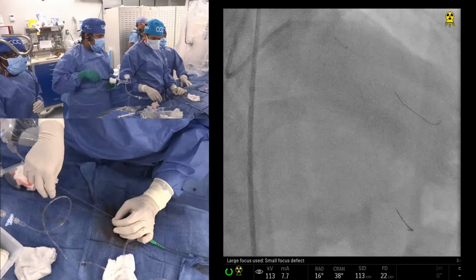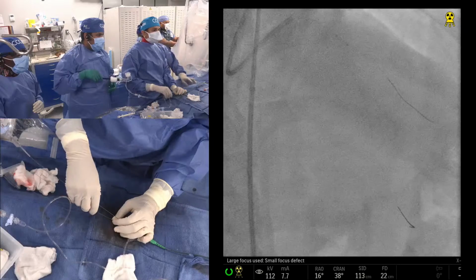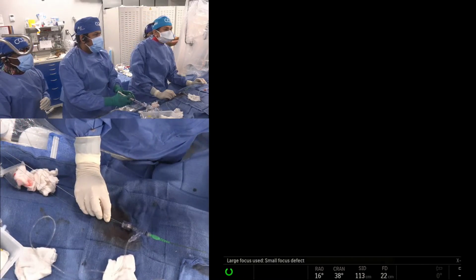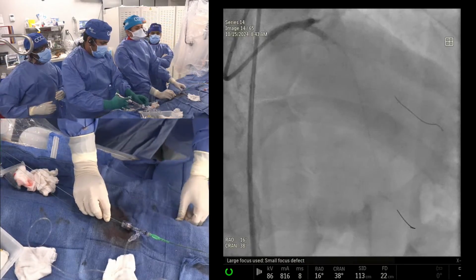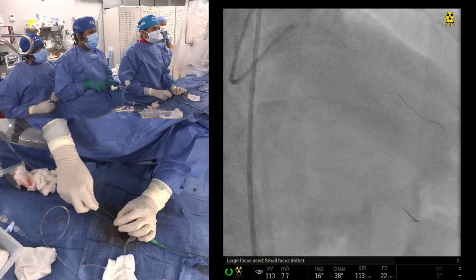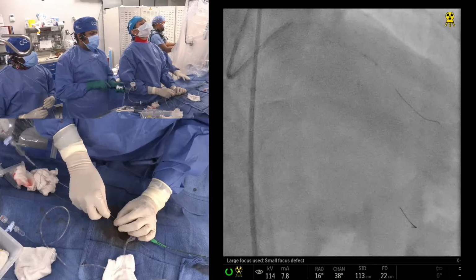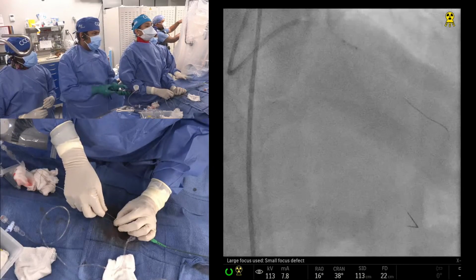Okay. Did the patient deny CABG? Well, I would say we didn't offer CABG to this patient because there were two lesions, not simple lesions. The SYNTAX score was in the intermediate range and LV function was good, but even by the guidelines, PCI would be the first approach. CABG could be done, but in this case we did not even offer it. We have the whole criteria, and we published that patients who should be referred for CABG and don't, their outcome is slightly lower than those who go for intervention based on the appropriate criteria. So in this particular case, we did not even offer CABG to the patient.